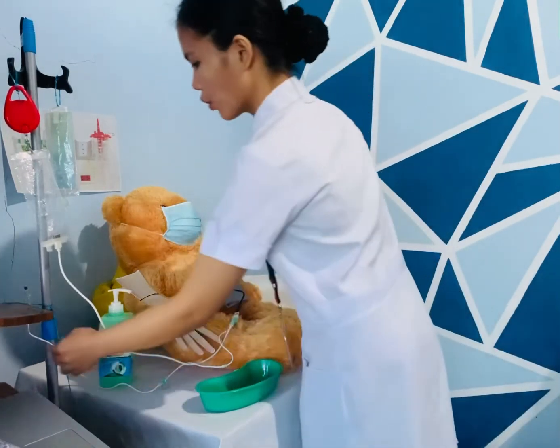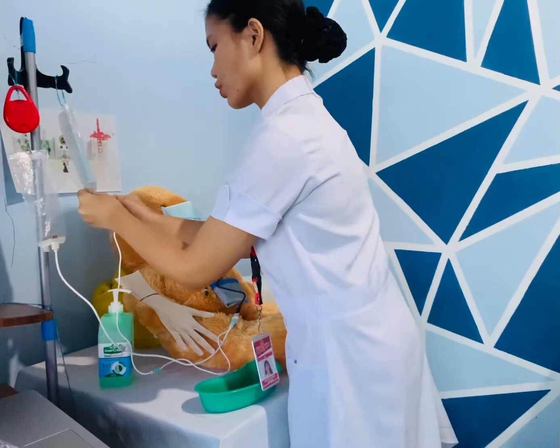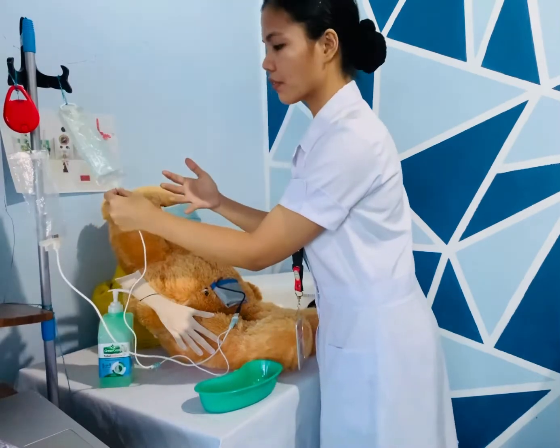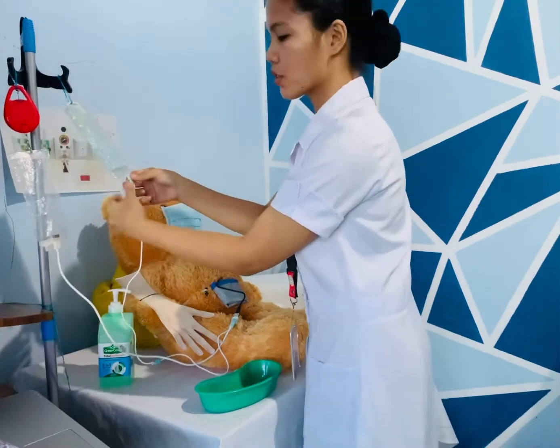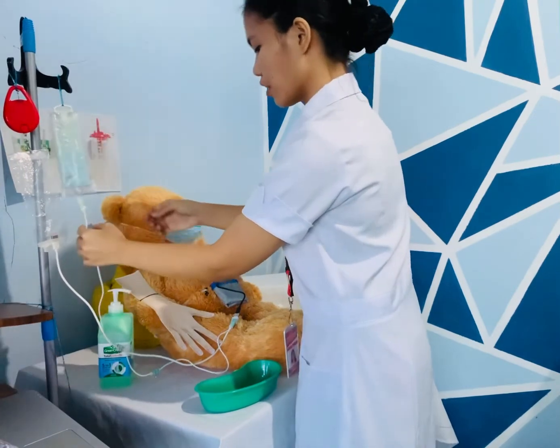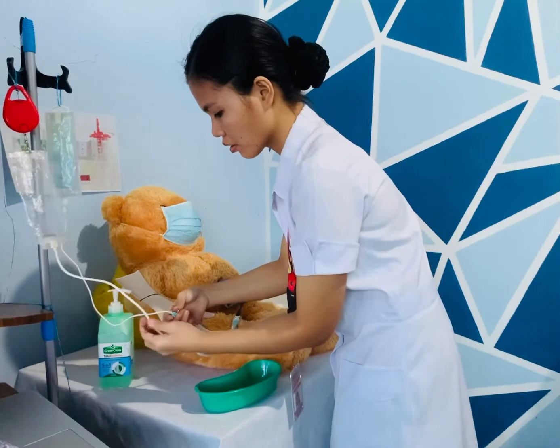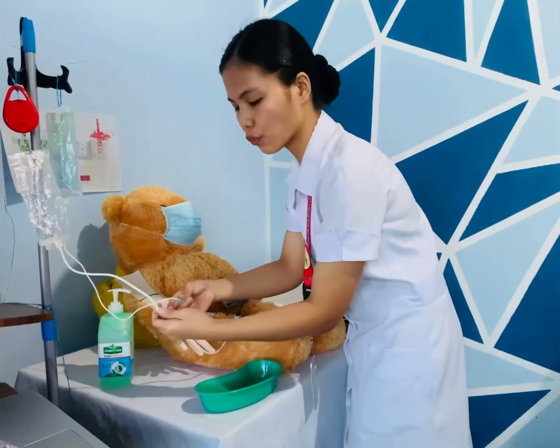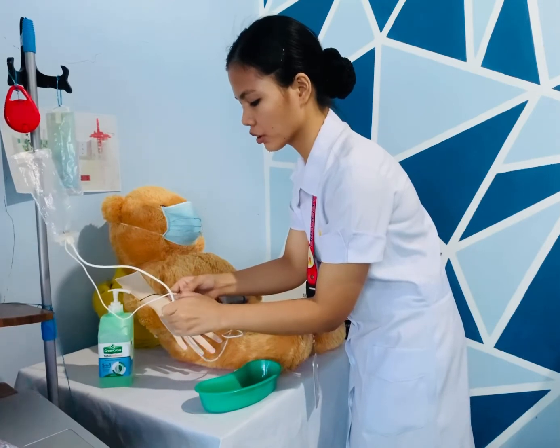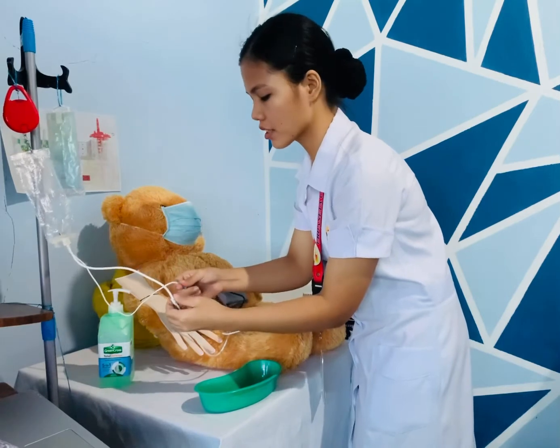Okay, so for the flushing and filling procedure, break the green frangible seal on the dialysis solution. Okay, so i-break natin to. Then open the white and blue clamps and do a count from 1 to 5. 1, 2, 3, 4, 5. Then close it after the counting ends.